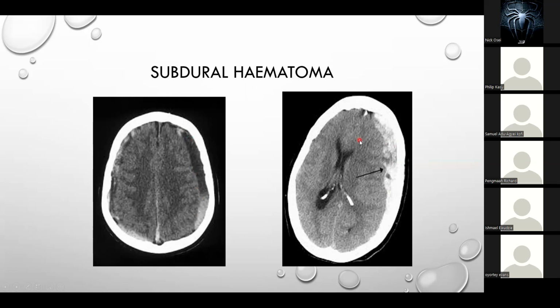So with these ones, when you pick up the CT scan, you should be able to tell immediately without waiting. Assuming the person goes to do it in the night, the radiologist obviously is not available in the night. So he'll come in the morning to write the CT scan report, and you are sitting there waiting before you refer to the neurosurgeon. That means I've wasted a lot of time. So it's important that we all know this.